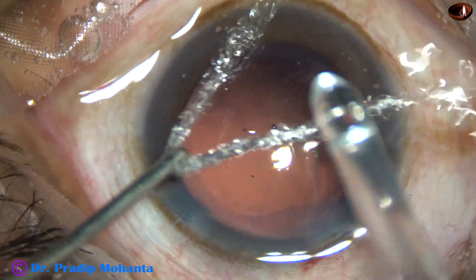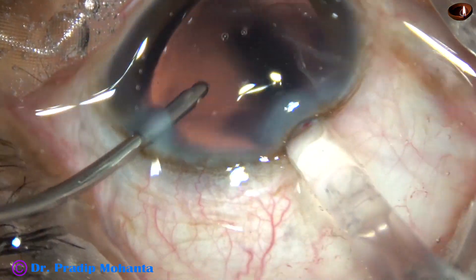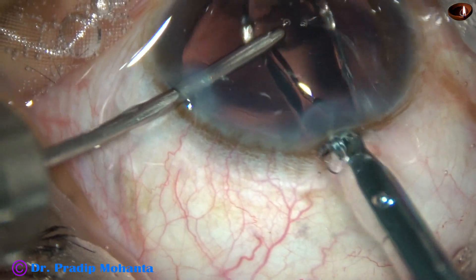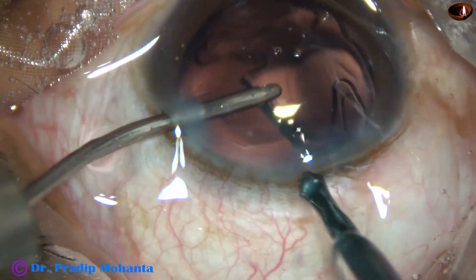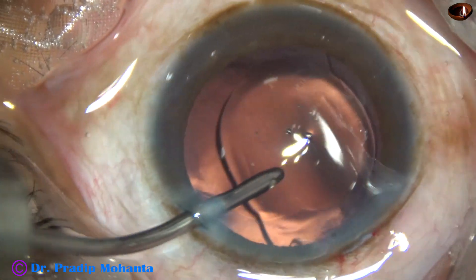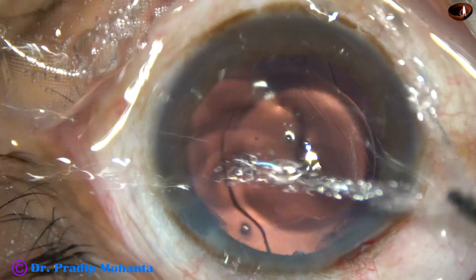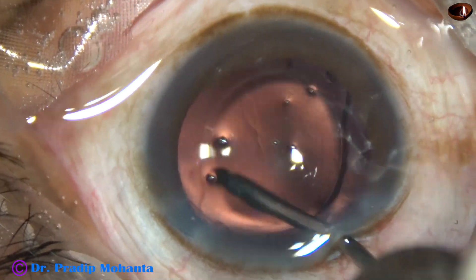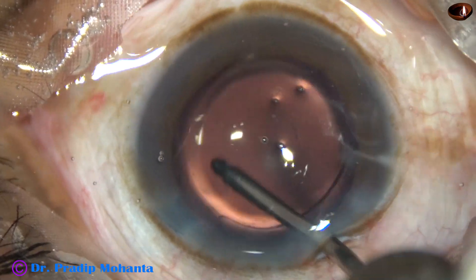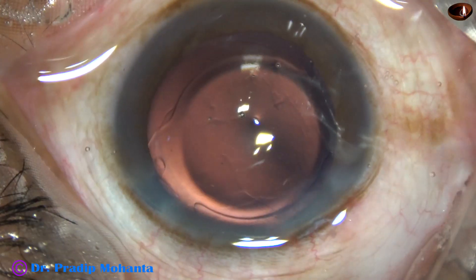This is hydroimplantation. Hydroimplantation means the anterior chamber is kept formed by irrigating fluid while the intraocular lens is implanted. Just by a push of the irrigating probe, the lens goes into the capsular bag. The lens is dialed by the irrigating probe, and at this time, whatever visco is in the lumen of the cartridge also comes out.